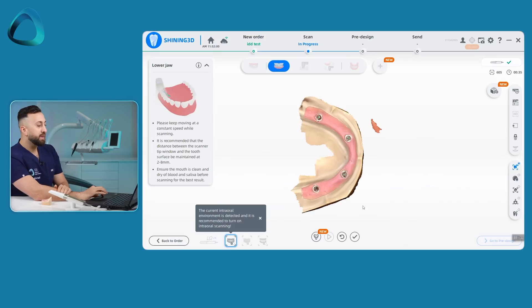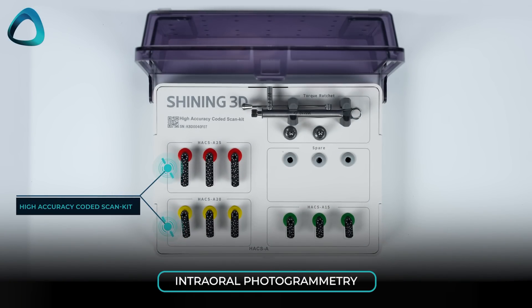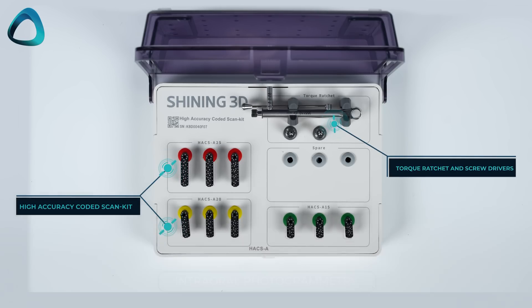Just like that, we have scanned the implants. We click the finish symbol and it takes us to the next step — ending scan. This is one of the most exciting things about all of this. Shining 3D could have easily just launched some flat scan bodies and called it a day, but they've actually created a whole workflow. You now have your implant positions, your multi-unit abutments, and the high accuracy coded scan body kit. These scan bodies come in a whole bunch of different lengths; you also get a torque wrench and some screwdrivers.